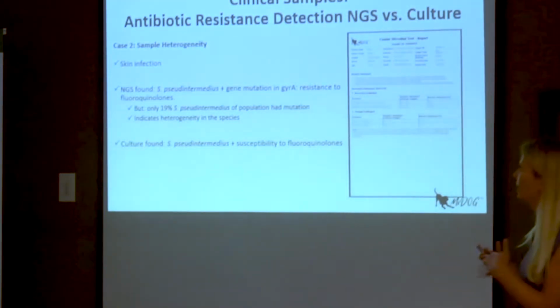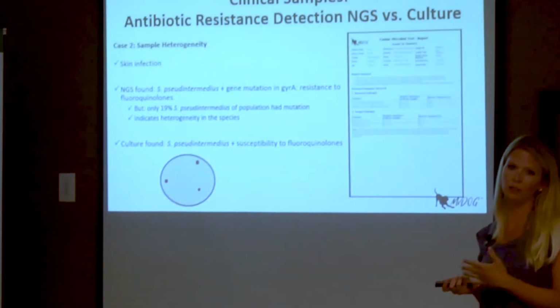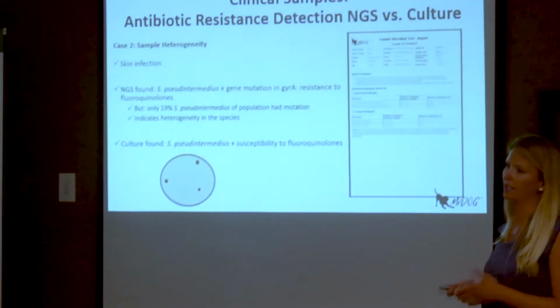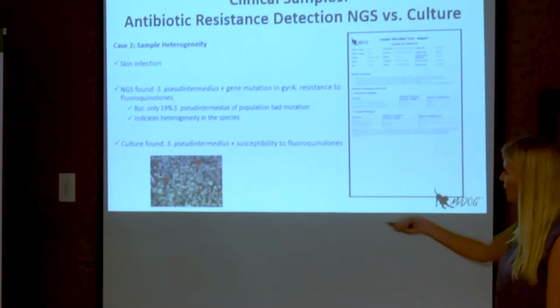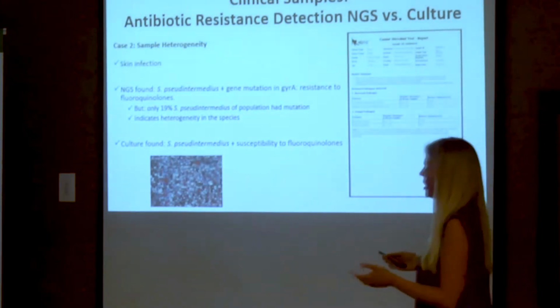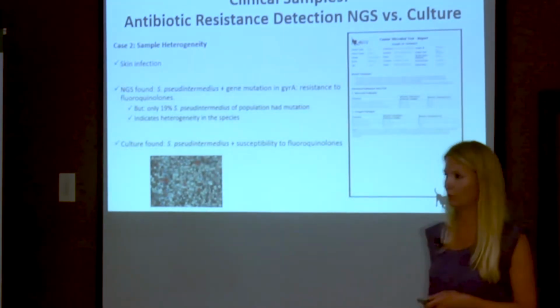But it just shows that if you have your agar plate, and even if you select multiple strains or colony-forming units of the same strain, it doesn't necessarily represent the entire species that is present in your patient, because there is such a huge diversity and there could be so many of them. So you're playing really a game of chance if you're picking this one or this one or this one, what the culture test will return.